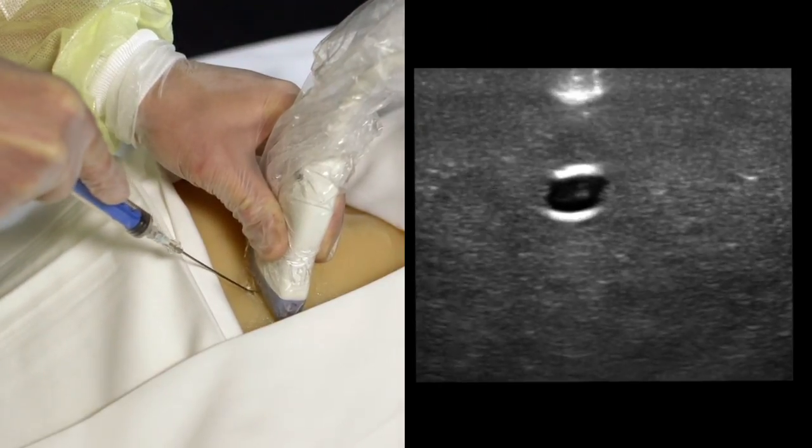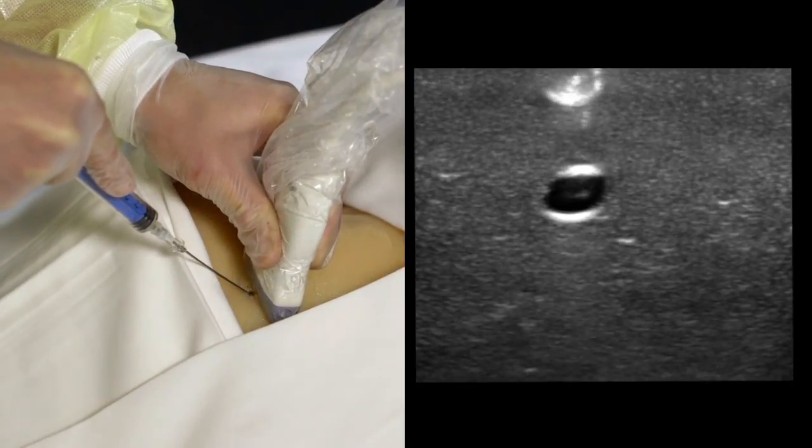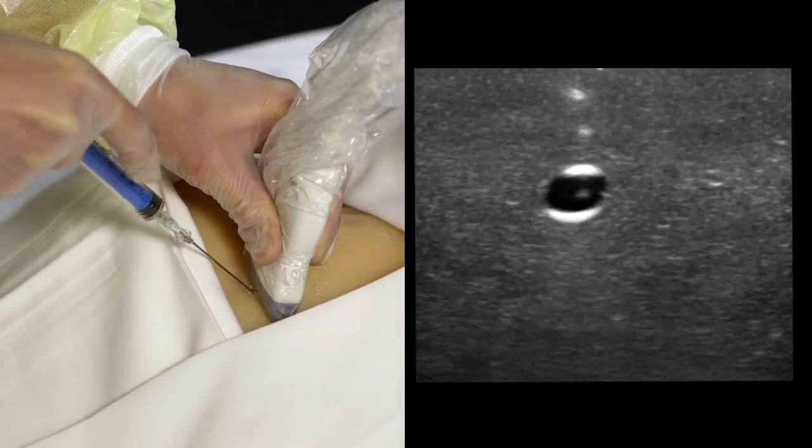Once through the skin, change your needle angle to a shallower angle. Keep the vein in the center of your screen. The needle tip appears as a small, bright, echogenic spot.